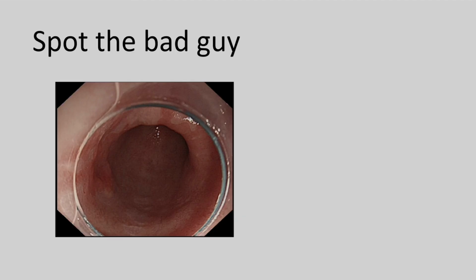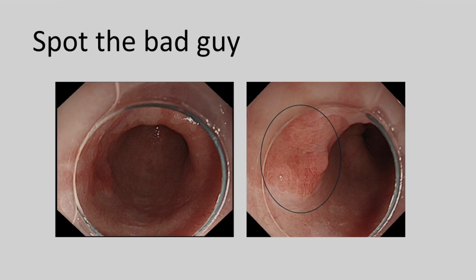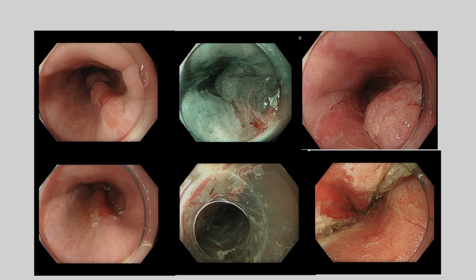So what we do, we've got the adjuncts, we've got the cap, which is good, and we've got a good endoscope to look at the lesion. What we need is to zoom in. That's where you find the bad guys, and then you can characterize the lesion. And this is an example of a Barrett's dysplastic segment. This is a weird lesion which is slightly longer than what we usually find in Barrett's dysplastic areas. So you then examine with white light, with narrowband imaging, and then you look for a loss of acetowhitening.